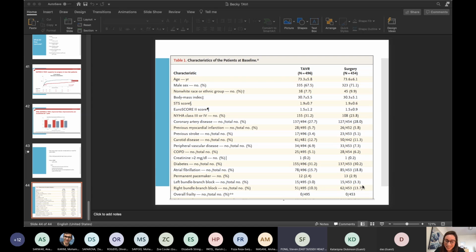I think Ben's asking me that because I tried to make him tell us about the ECG. We do put TAVI valves inside existing valves, so there's TAVI in TAVI and TAVI inside a surgical valve. I'm not sure of the current evidence base, Ben.